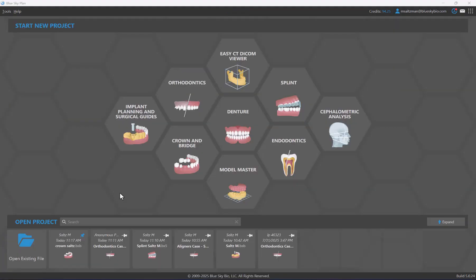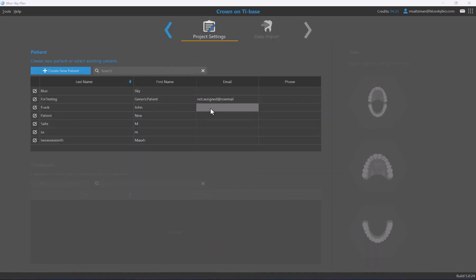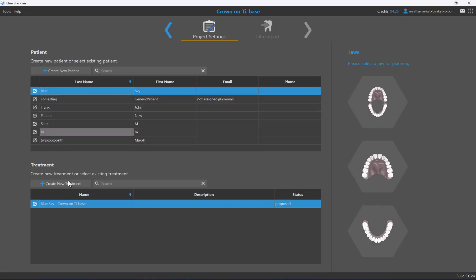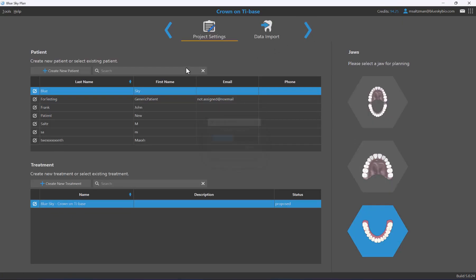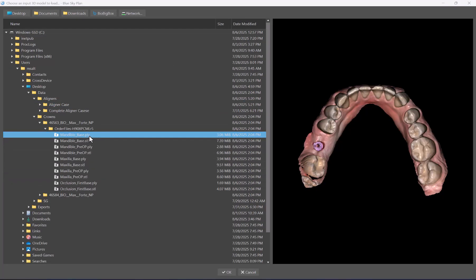Now that we've explained the three introductory screens, let me demonstrate — it really only takes a couple of seconds. I'll start a new case for a crown on titanium base: click crown and bridge, crown on Ti-base, select the relevant patient from the list or create a new one. I'll select our existing patient Sky Blue, confirm the treatment, and click next.